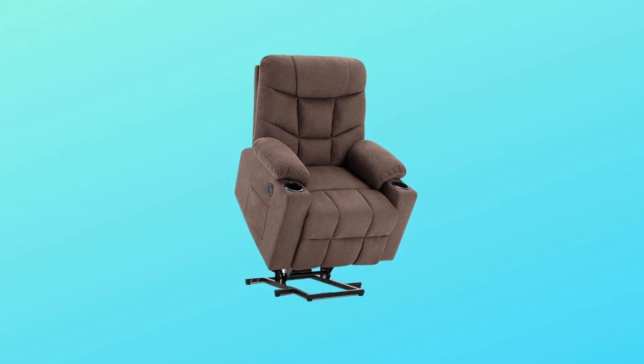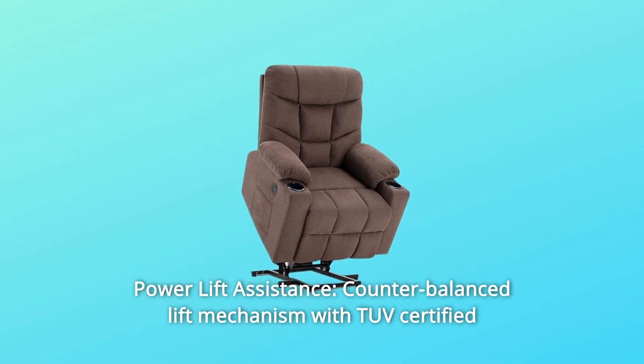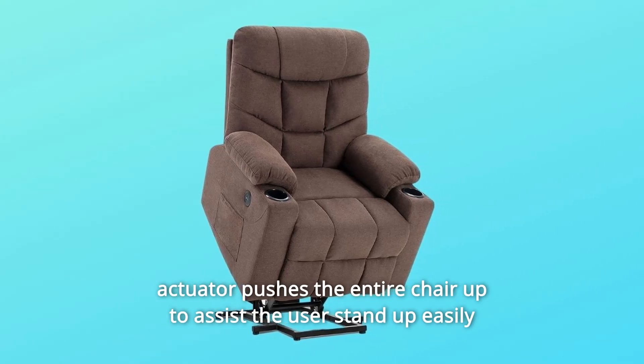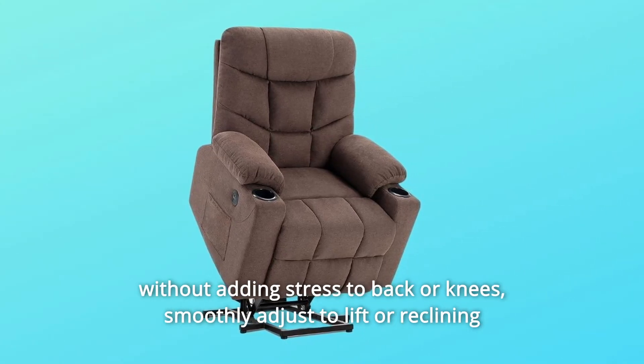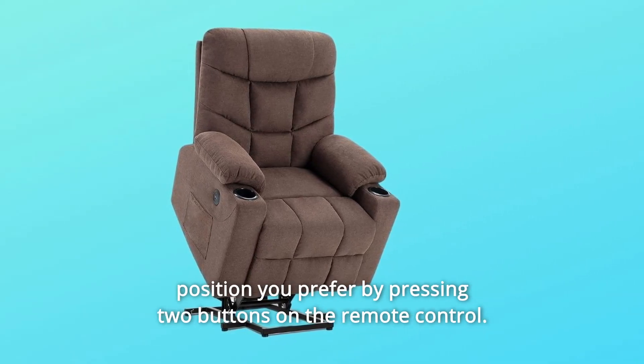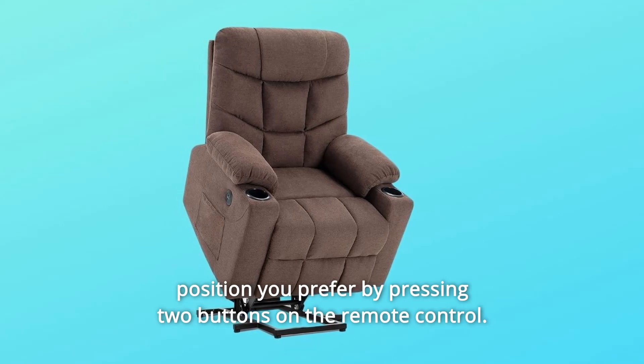Number 3: Power Lift Assistance. A counterbalanced lift mechanism with a TUV-certified actuator pushes the entire chair up to help the user stand easily without adding stress to the back or knees. Smoothly adjust the lift or reclining position you prefer by pressing two buttons on the remote control.